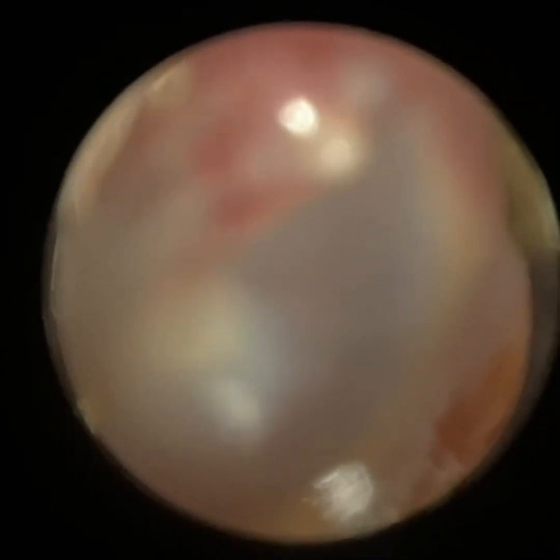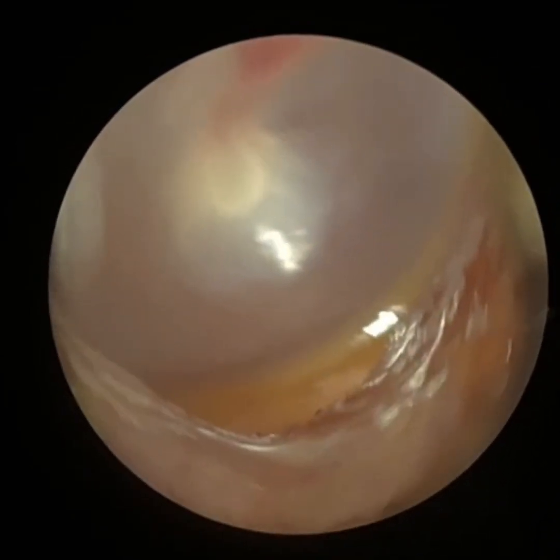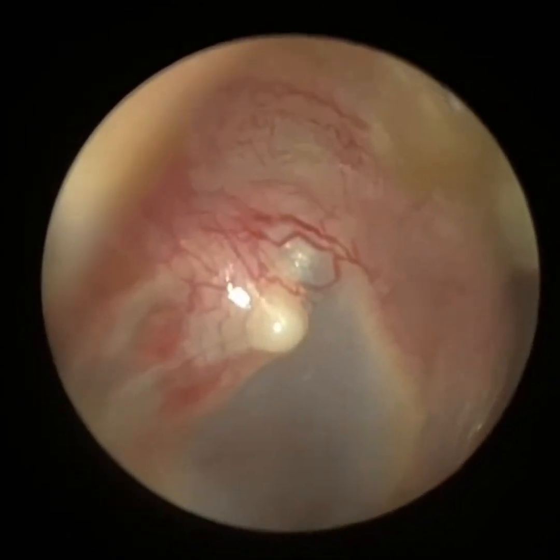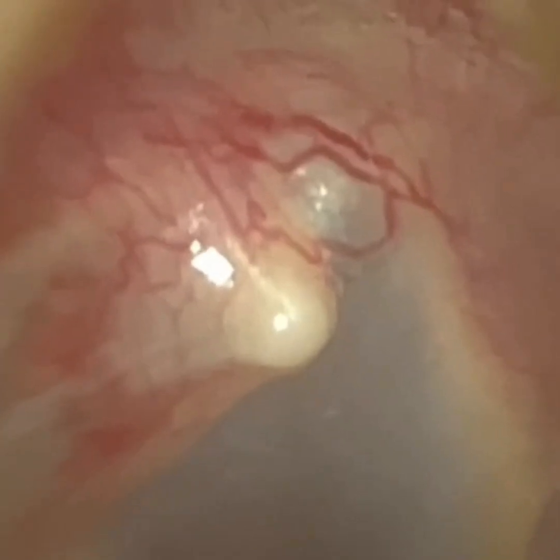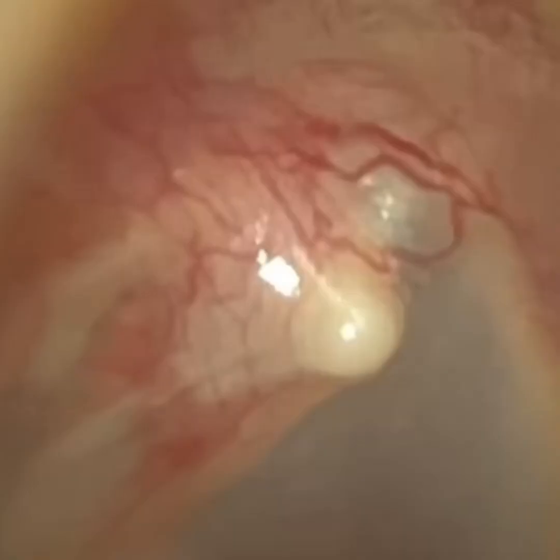Then he's got a great view of the eardrum. He's going to get this into focus — you can see the hammer bone. The annulus is around the perimeter. He's going to zoom in on the short process of the malleus because it's protruding somewhat. Some patients have a really protruding short process. Well, I hope you enjoyed that video, guys. Take care, keep well and speak soon. Bye.